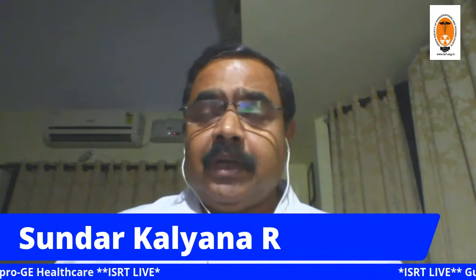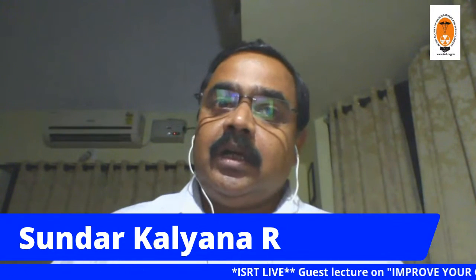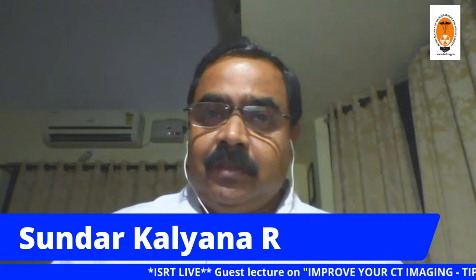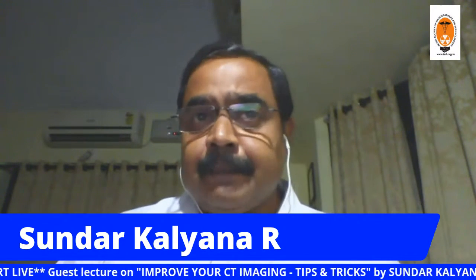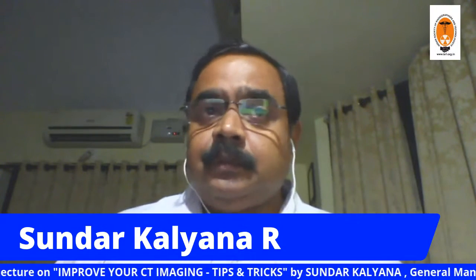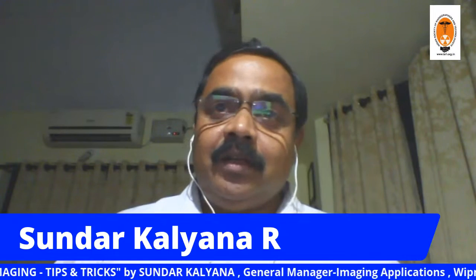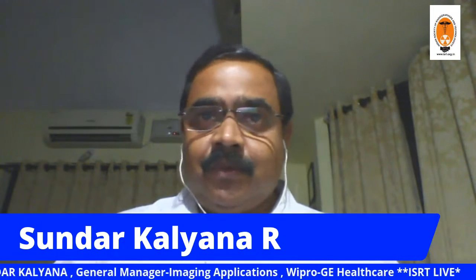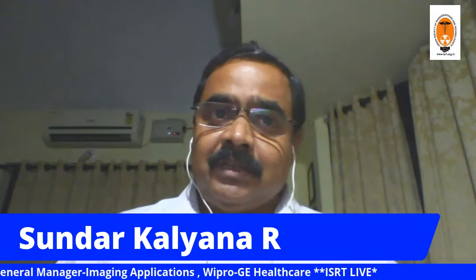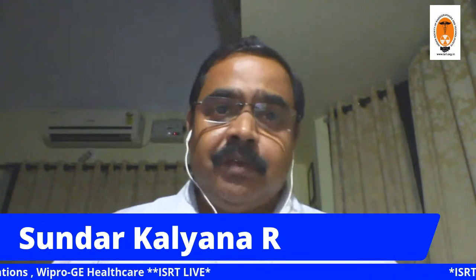And of course, a very important thing in a pediatric study is to ensure that the pediatric patient is sufficiently sedated when you do the scan. Many times I have seen that as you inject the contrast, especially in a cardiac run, the patient jumps, you have already injected, a few monitor scans are over, and suddenly within a few seconds the scan is also over, giving no results.